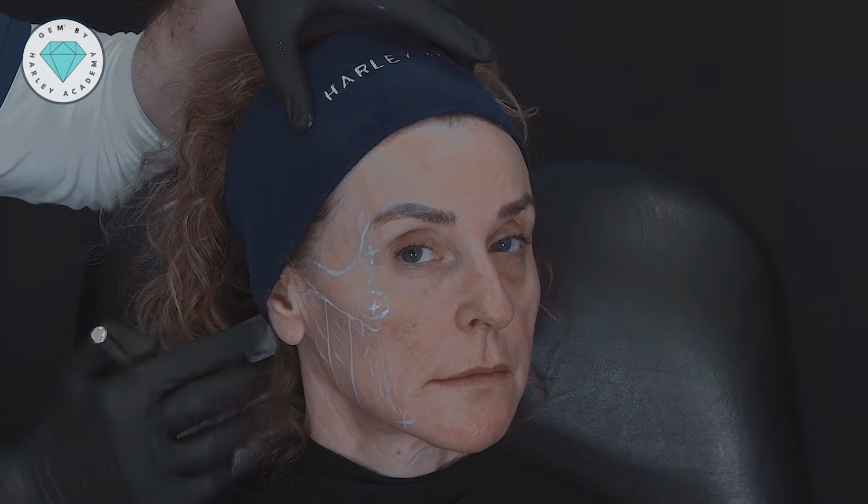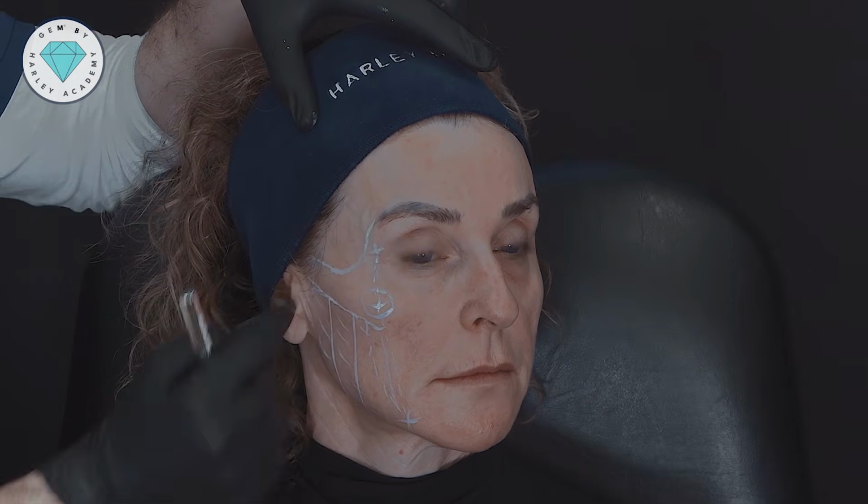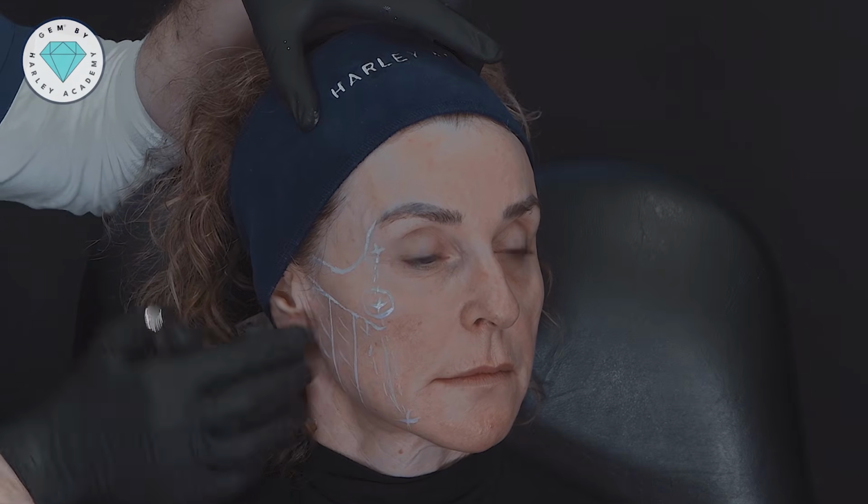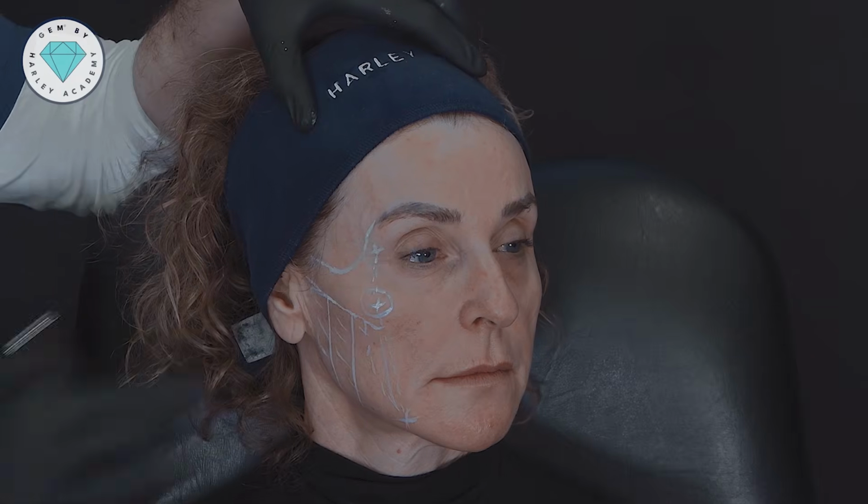So the treatment sequence number one is going to be the lateral midface, which is going to be the apex of the cheek, the lateral zygoma, and what we would call collectively in this area the preauricular and subzygomatic and submalar region. So let's do that treatment first. I'm going to just talk about the technique first. So this one will respond very well to a cannula treatment. And I'm going to show you how we use a cannula to treat the apex and the lateral zygoma from a singular entry point, which will be from around here.